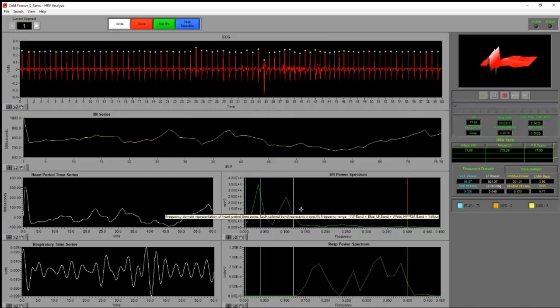It's simply an amount of time, but it is including those sympathetic effects. If we use RSA, we can tease apart those sympathetic effects on the heart rate and get a pure metric of the parasympathetic nervous system, or the vagus nerve's regulation of the heart rate. That's the real advantage of using RSA over RMSSD.